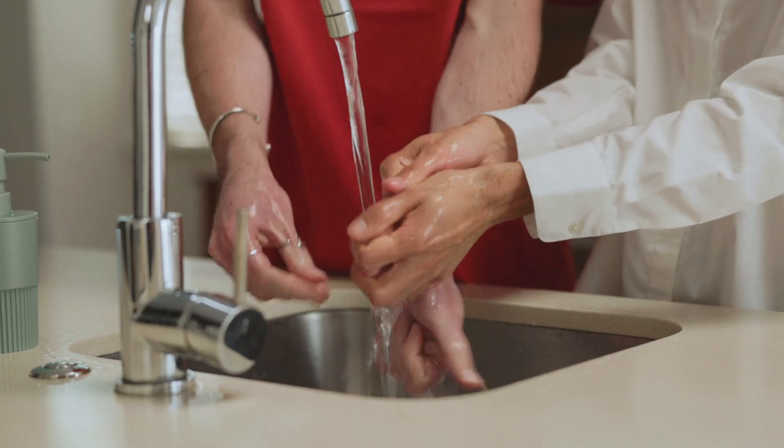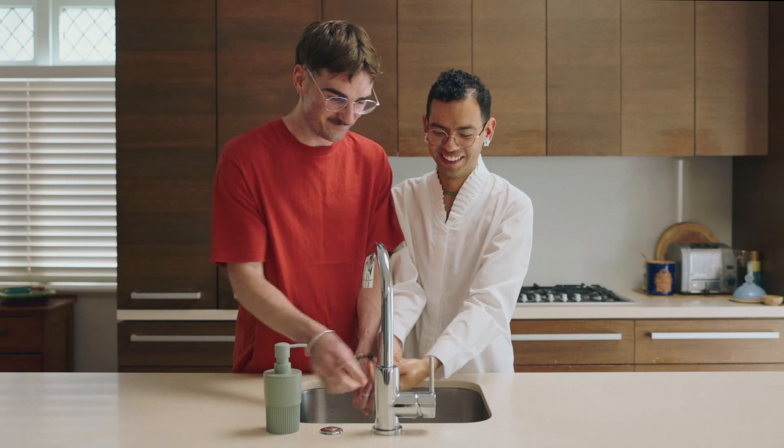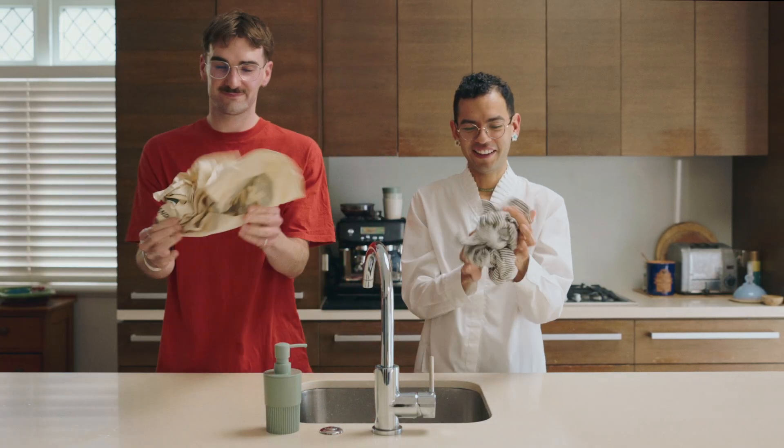Step 1. Wash and dry your hands. It's best to use warm water as this helps blood circulate to your fingertips.